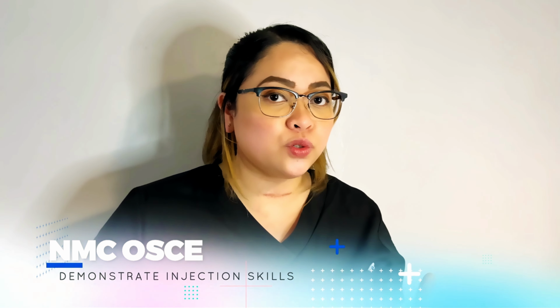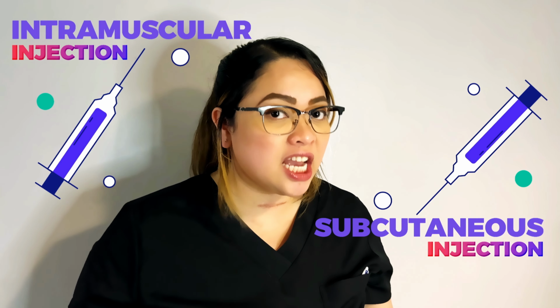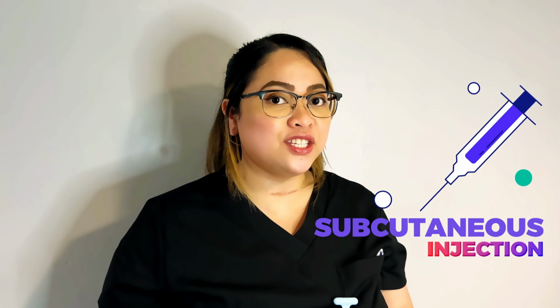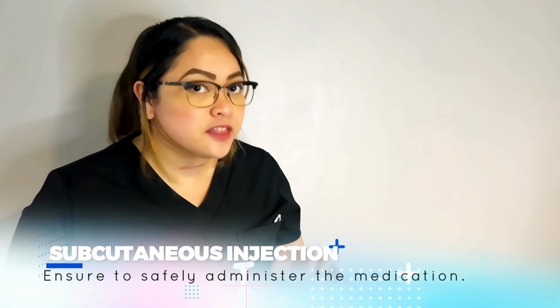In the NMC OSCE exam, the candidate needs to demonstrate injection skills, whether subcutaneous injection or intramuscular injection. And yes, today I am going to show you how to do a subcutaneous injection. You have to do this skill within 12 minutes. Nurses, always remember, in this station, ensure to safely administer the medication.